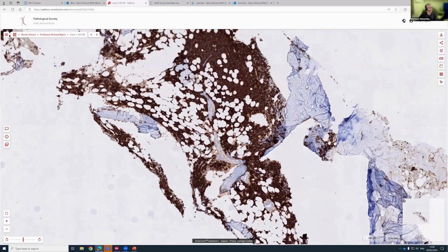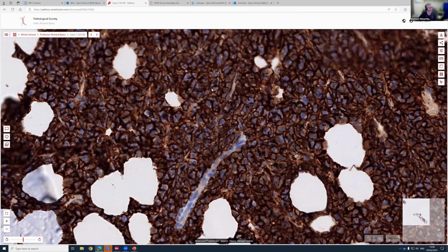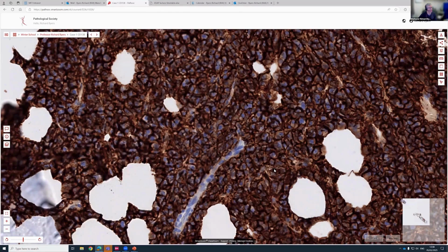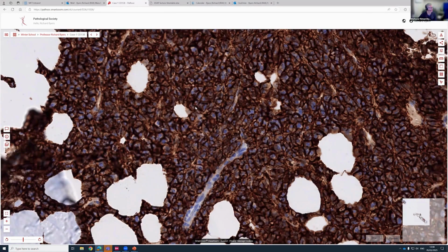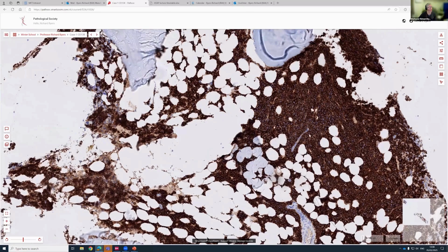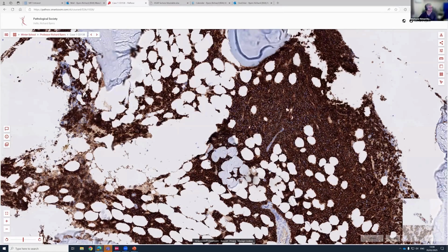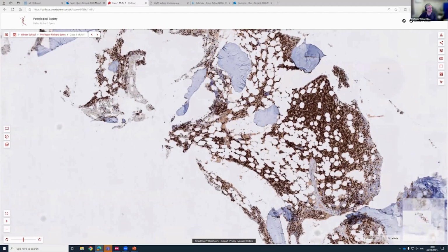And what we're looking for is nice cytoplasmic staining. So all these cells are probable plasma cells or plasmacytoid differentiation. Of course, there may be epithelial cells, but hopefully, they're not epithelial cells. It doesn't look like carcinoma anyway. But if you see a 138 positivity, you've always got to consider that possibility until you look at the MUM1 as well.